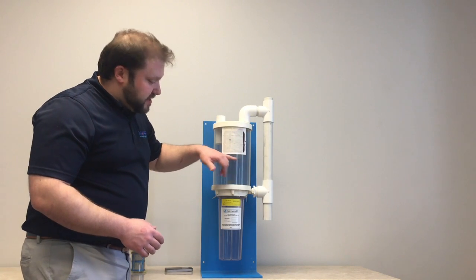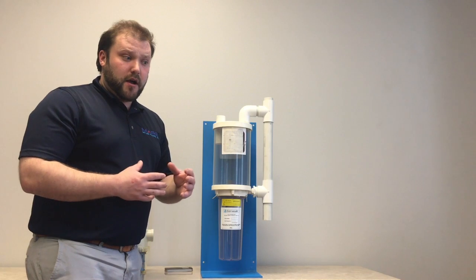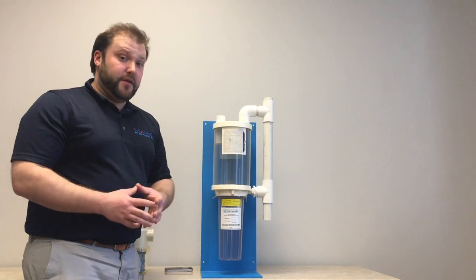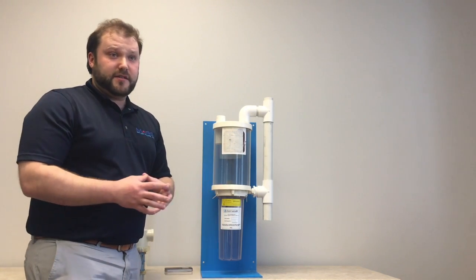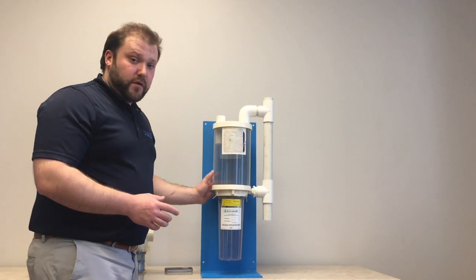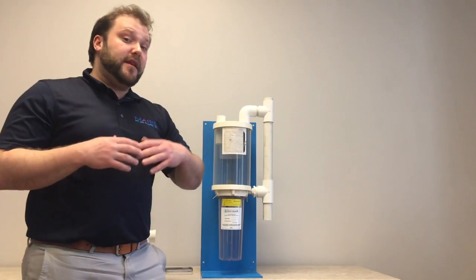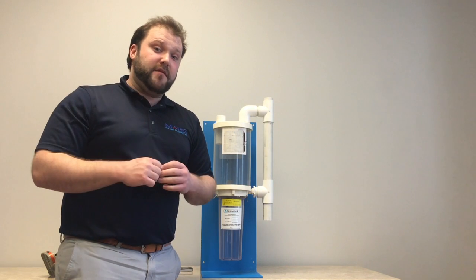But if you have sludge up to here, you're looking at about 3 or 4 filters worth of buildup. And you'll be going through 3 or 4 filters within a month's period, roughly, just to clear your upper chamber clog. This could cost a significant amount of money, and to buy a full unit would be the least expensive and more economical route.